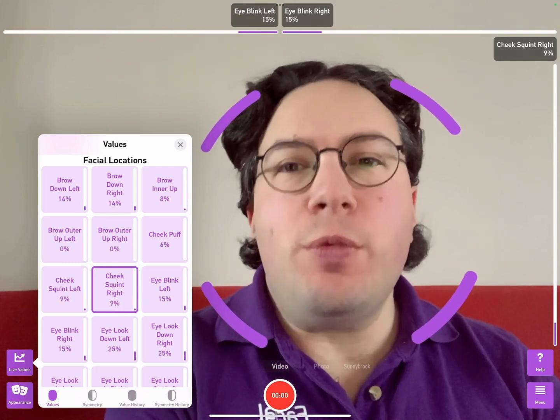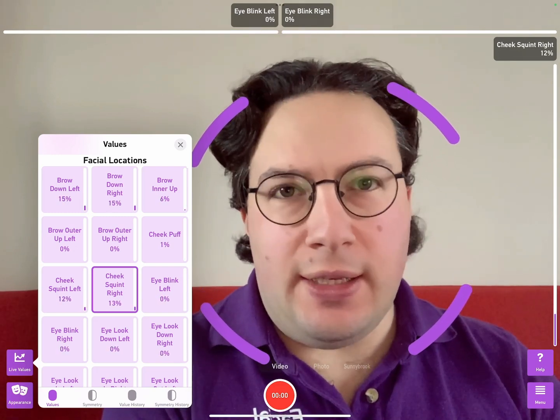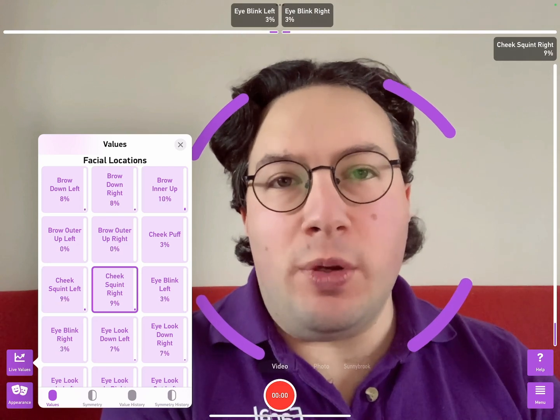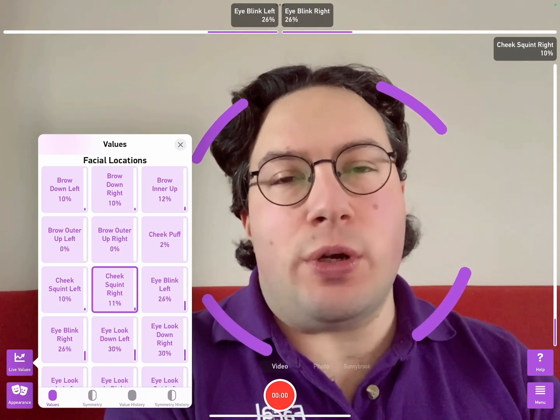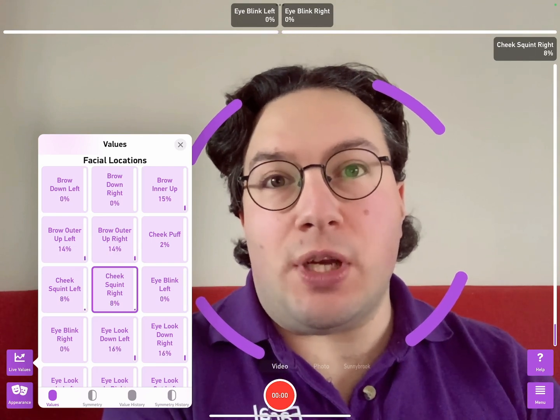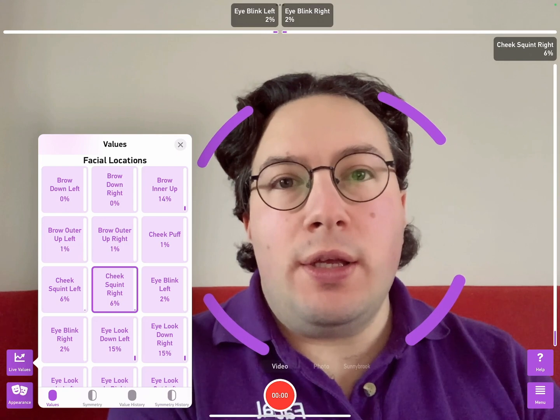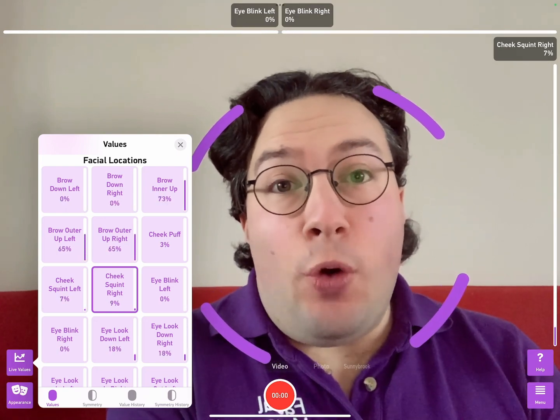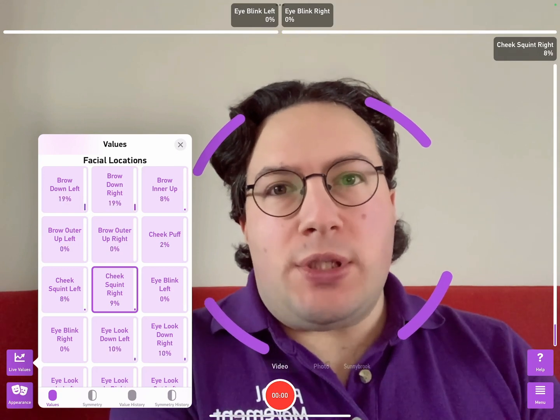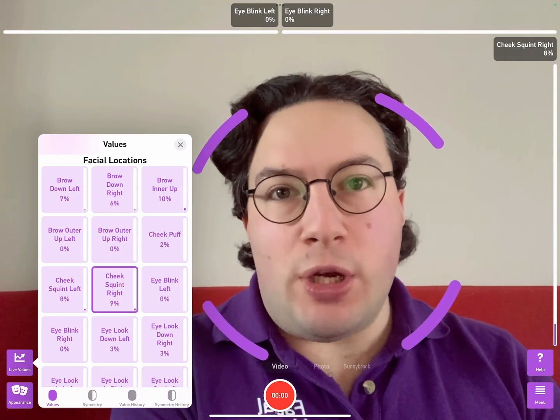It's called Facial Movement Recorder, and it's been designed to help analyse facial palsy. That could be weak or absent movement, for example, after a stroke. It could be asymmetrical after an injury or surgery, or tremors, for example, Parkinson's. Facial palsy from all these causes and more affects thousands of people in the UK. It affects not just the more obvious things like speaking, but also self-confidence and mental health. It can even affect nutrition and hydration.